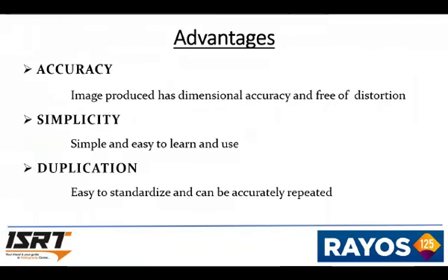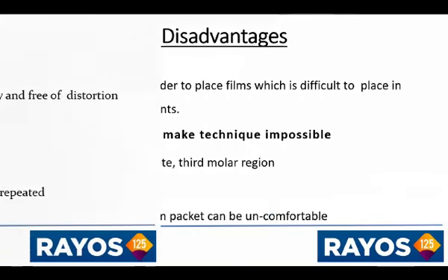So the advantages of the paralleling technique are: one is accuracy. The image produced has dimensional accuracy and is free of distortion. And simplicity, simple and easy to learn and use. Duplication, easy to standardize and can be accurately repeated.